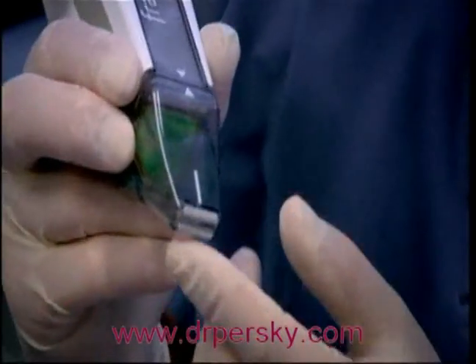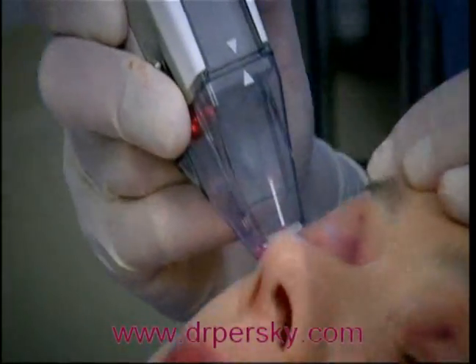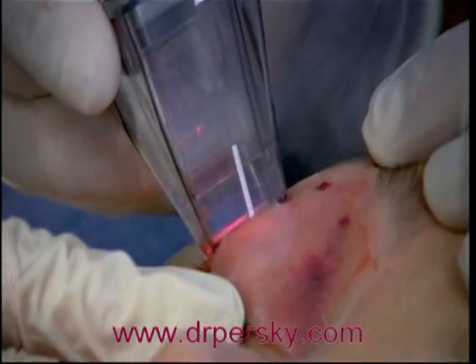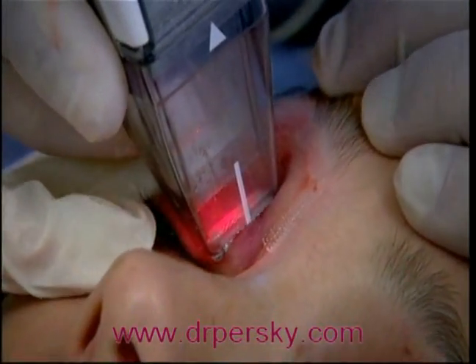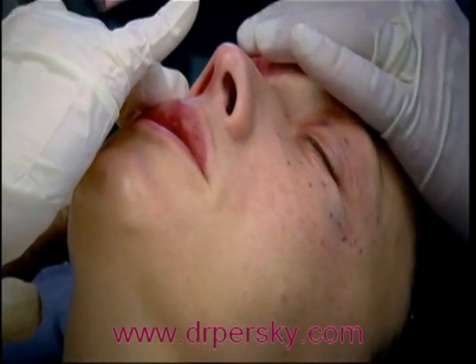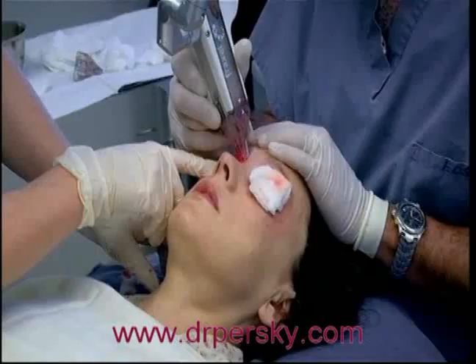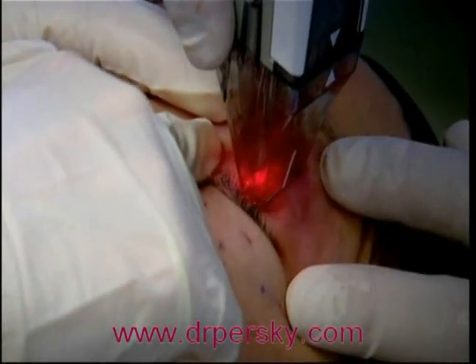This is actually a vacuum that pulls up the debris. And here we go, okay? Do a great job, won't you? We will. The laser works by permanently removing 30% of the skin it touches, leaving thousands of tiny holes, sort of like a tea bag. As the holes heal, they close up, resulting in tighter skin. How much longer? About 2 minutes.